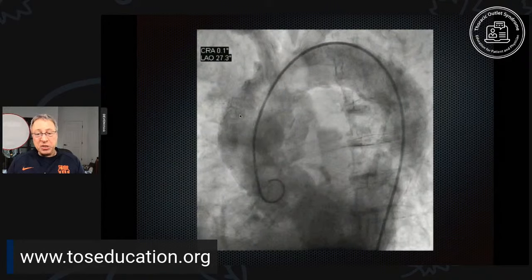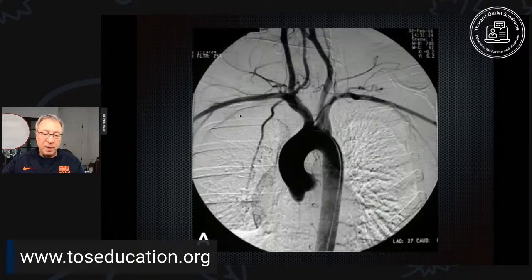And you see an X-ray tube suspended over the patient with the X-ray images projected on the back wall there. Here's an example. This is a catheter that came all the way from the artery in the leg, and it's way up near the heart in the aorta, the largest vessel in the body. And when you inject contrast, it can show up white or black. That's not important, but you can fill the arteries, and you can see the arteries separate from everything else. So it's a neat little trick.